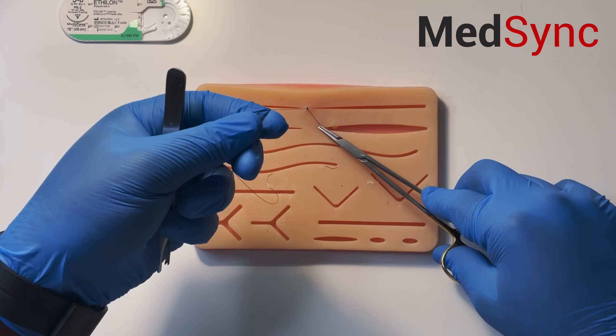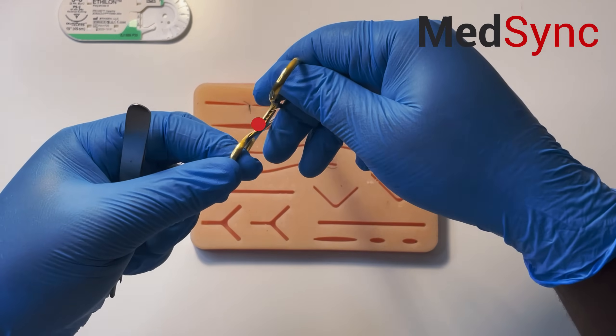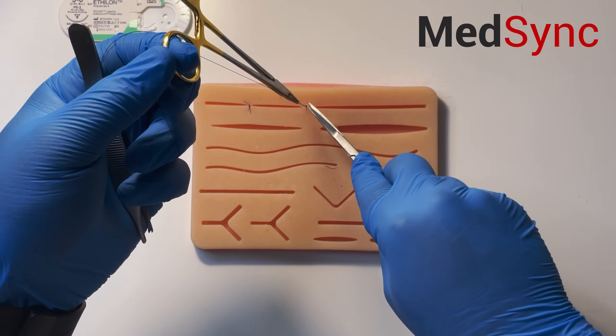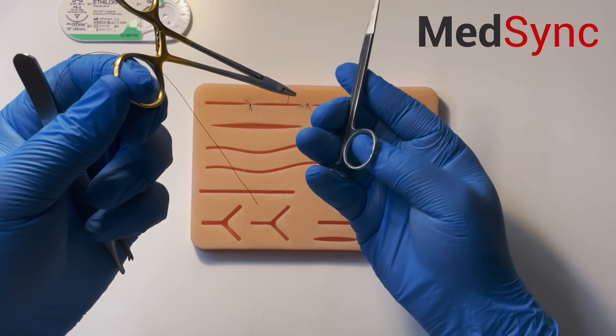You pass all the instruments into your left hand. You flip the scissor, you open, you cut, and you rotate.